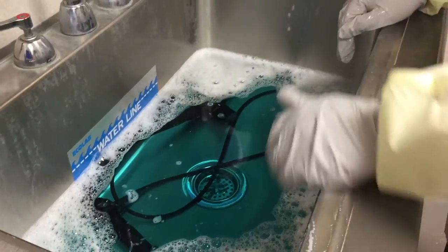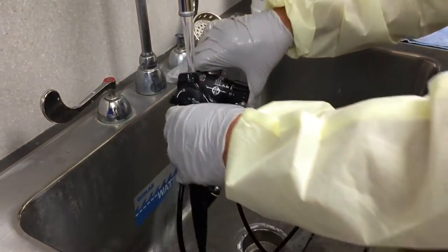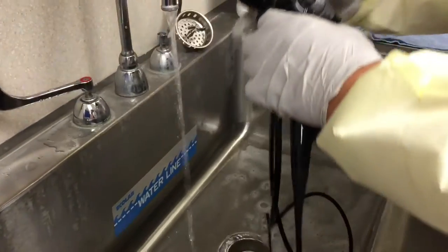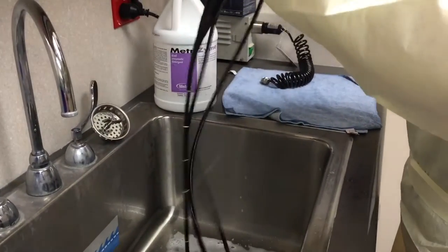We'll leave the scope in the water, the soapy water, for about 5 minutes. We drain the soap out, now rinsing the scope before putting it in the machine.